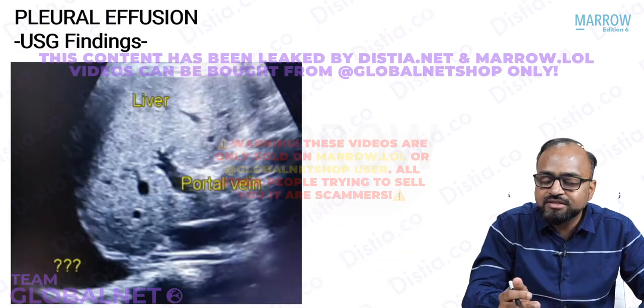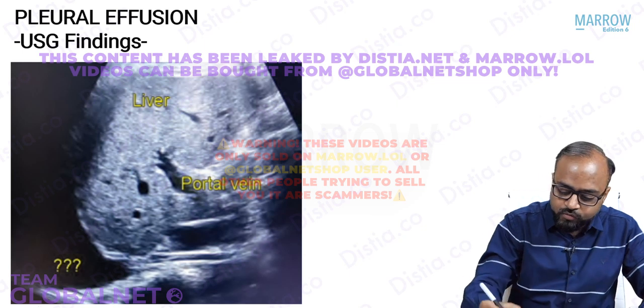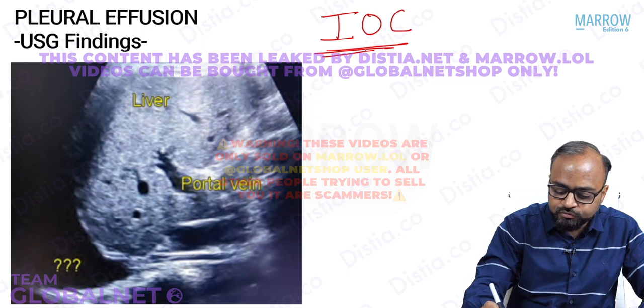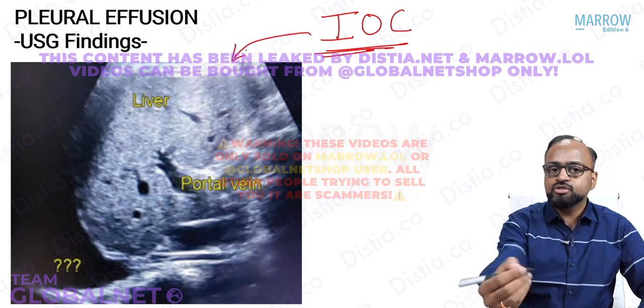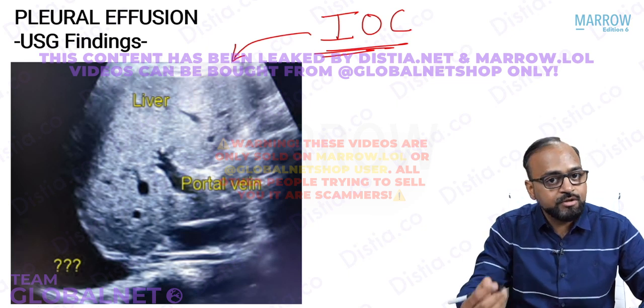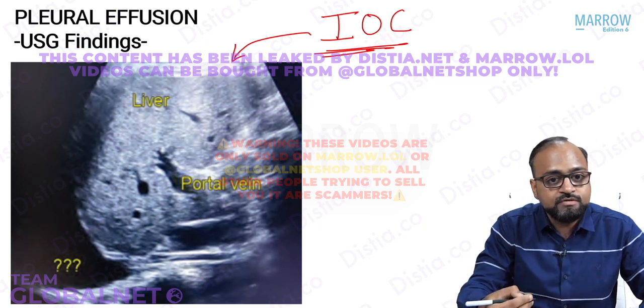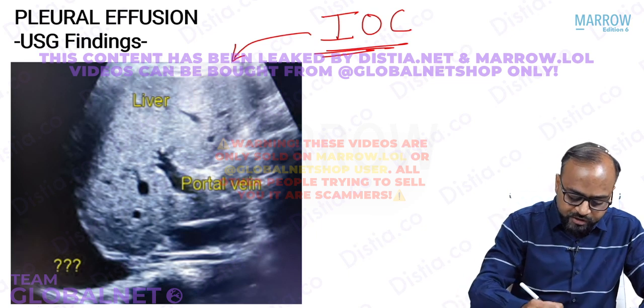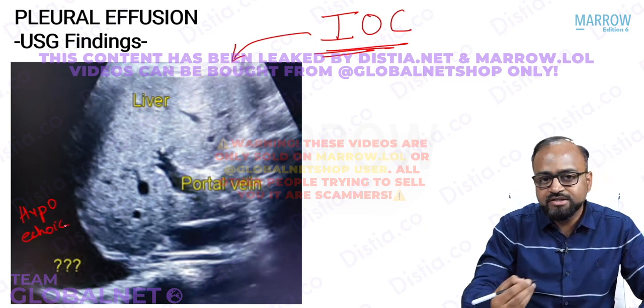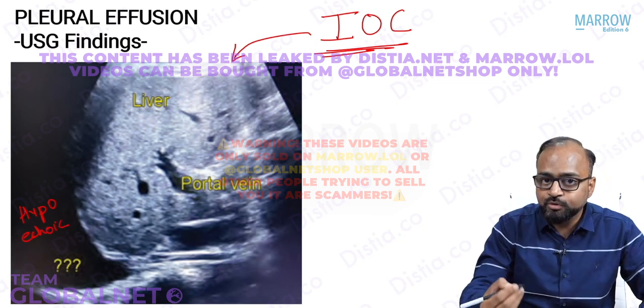Now, when we started this discussion, I told you that the overall investigation of choice for detection of pleural effusion is going to be ultrasound, because fluid is friend of ultrasound. We have discussed this in the ultrasound interpretation module as well. How does fluid appear on ultrasound? Fluid appears hypoechoic or anechoic, depending upon whether it is clear or turbid fluid. So it appears hypoechoic or black.